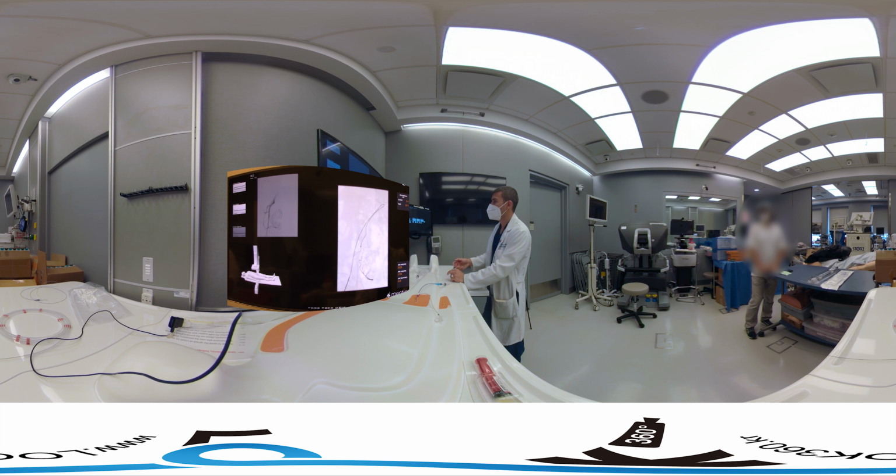And what we're trying to look for is, again, stasis or near stasis, where it sticks around for 5 heartbeats. See how slow it's going now? We're getting very close to the end point versus stasis itself. So we're going to give it a second, just give it a little break, and then we're going to embolize again and see right there.